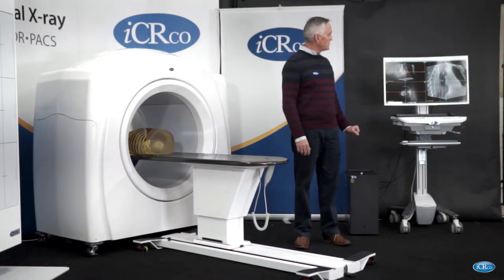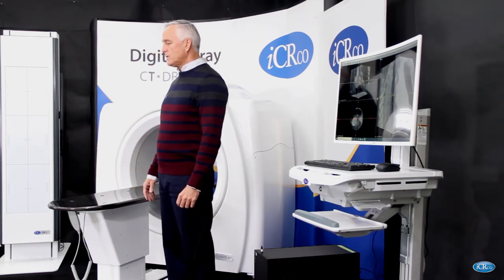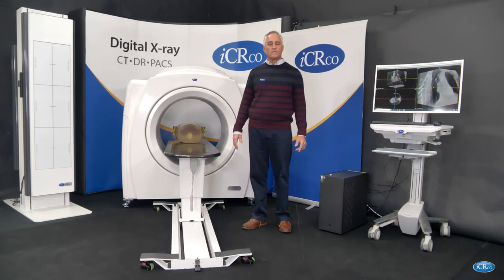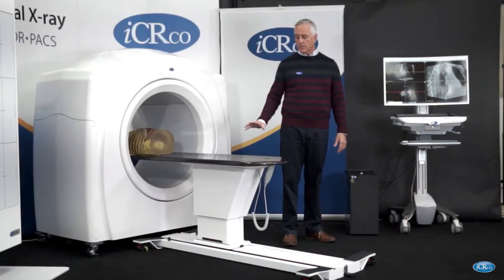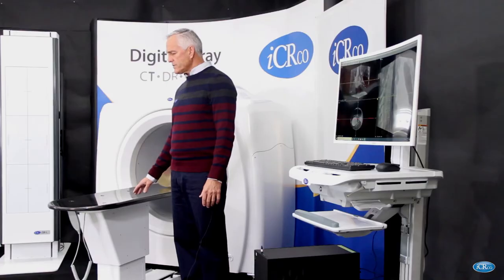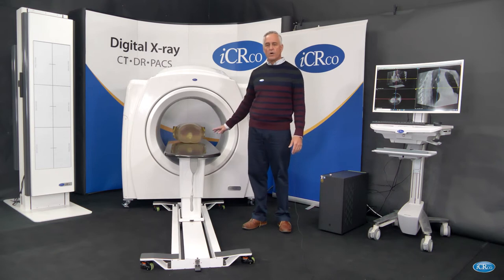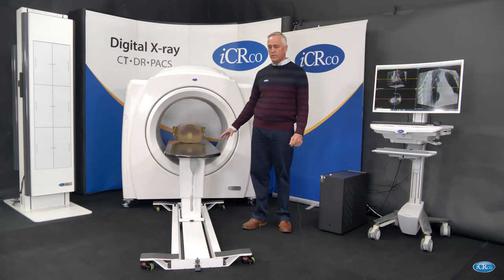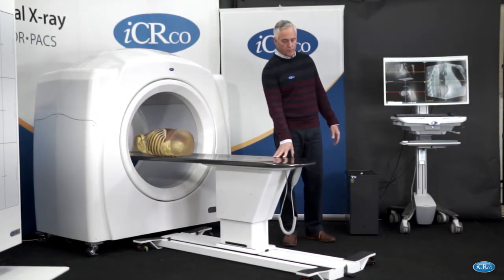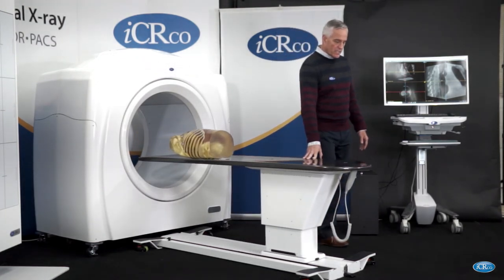This is an example of a chest image that we took using this Claris CT system. Once again, we have great hopes to use this device as an early detection system for the coronavirus. And considering that this can be deployed in small facilities, in small hospitals — it's very portable and can be used in field deployable hospitals — this will be a very good application for this machine.